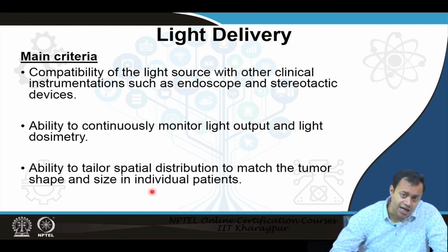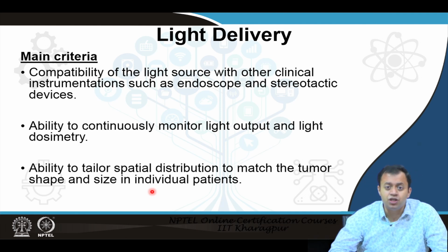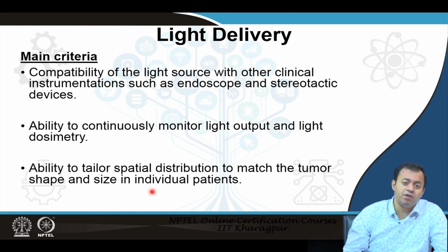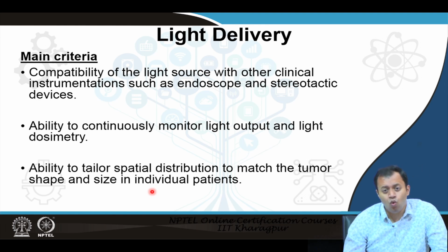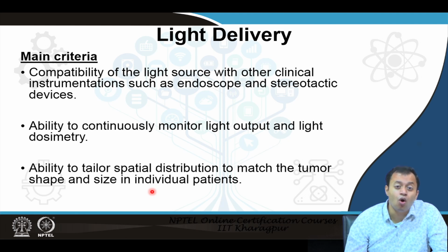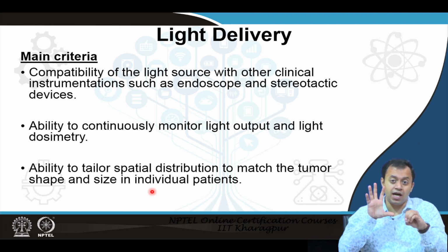So, utilize that chart, and it will be helpful in determining what wavelength of laser you need to send at what intensity, what power density, etc., to destroy either different types of tumors or the same type of tumor of different sizes, small and big.